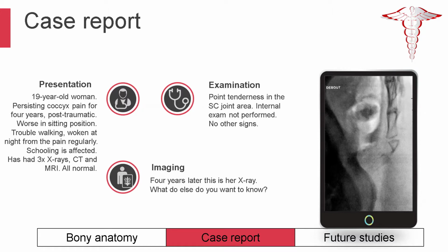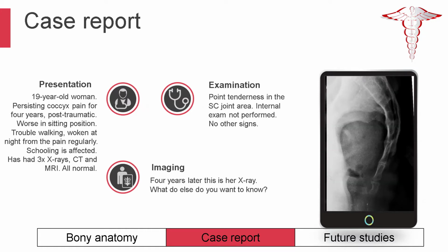She has at least one or two patent joints. Is there a compression of that one you're pointing at? It's more of a triangle rather than a square shape, it looks funny. Yeah, we just looked at it and like, that looks weird. And so we're like, okay, do you have any other X-rays? So she had the X-ray she did on day of injury, and that's what it looked like.